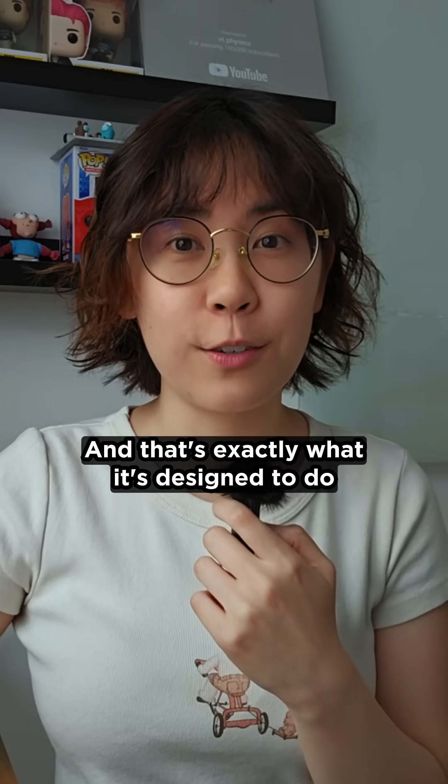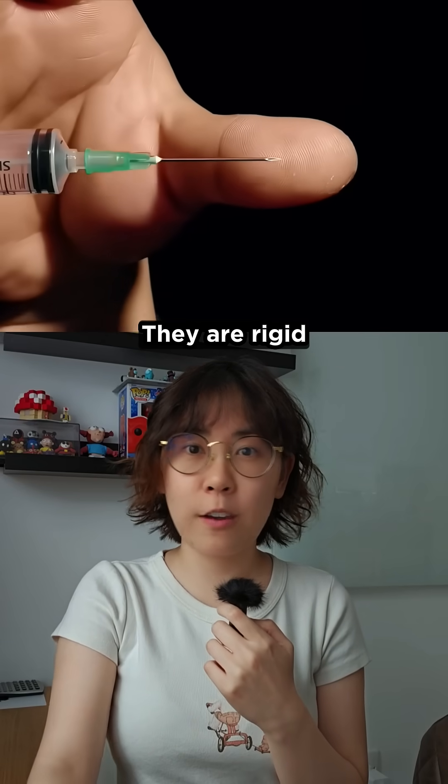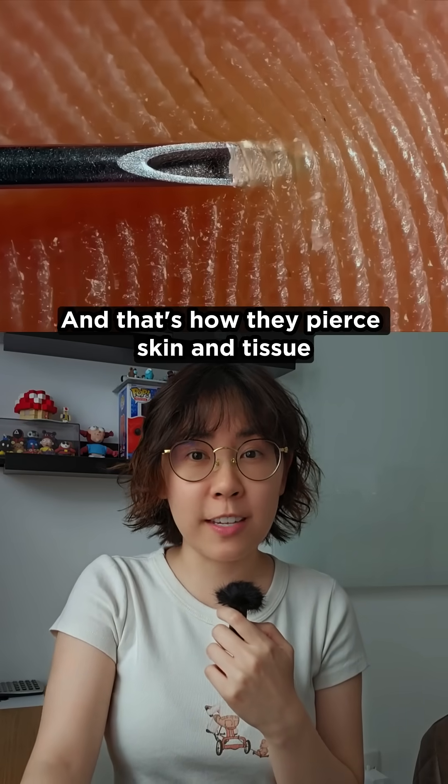Did that needle just go floppy? Yep, and that's exactly what it's designed to do. Medical needles are usually made of stainless steel. They are sharp, they're rigid, and that's how they pierce skin and tissue.